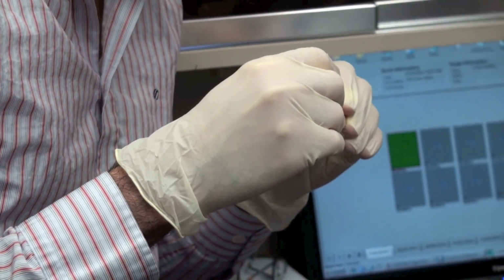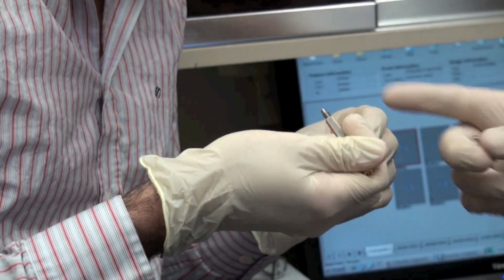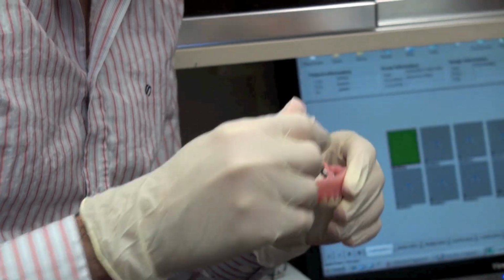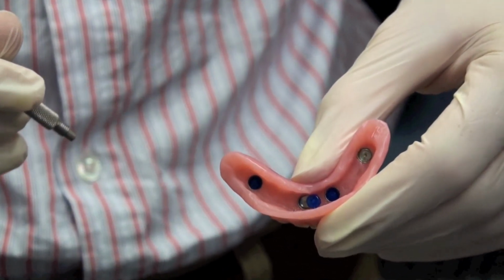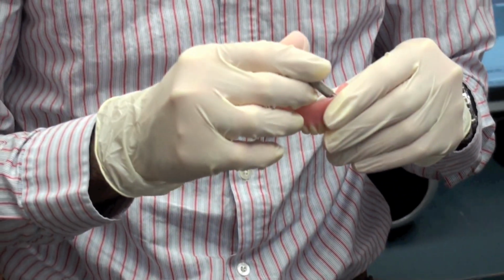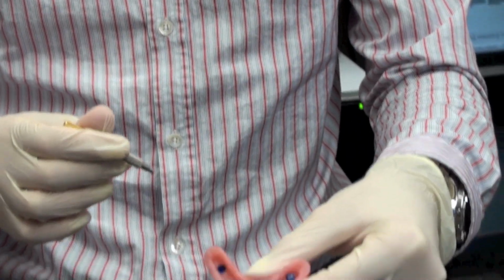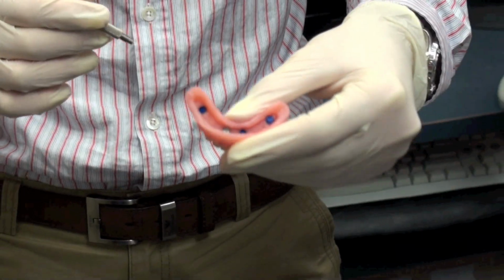So you want to have it so that there's a little dot on the inside of it, and the little dot fits inside of that. Oh, I see. It's upside down, so show them upside down. So you can see a smooth back of the one in the middle. So you don't want to try to put it in that way. So you'll flip it over. Just trying to flip that guy over is a little hard. It's tricky. So then you snap it down in.